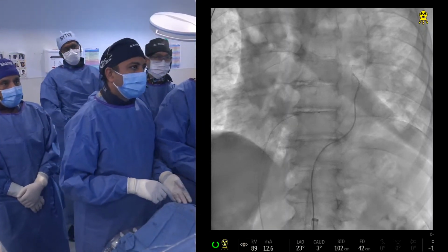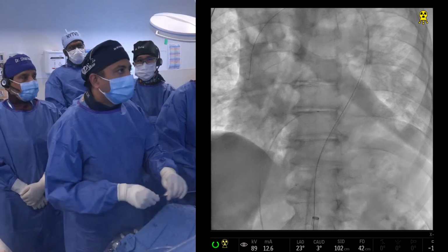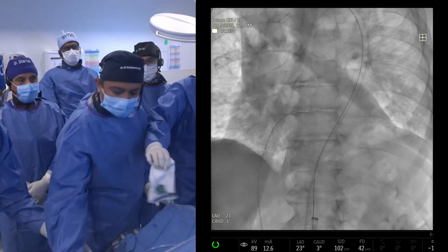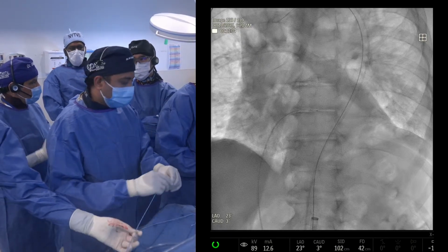Although that trial was flawed in my opinion, having an 11% mortality, which has never happened with the, but in that trial did happen, that was a big difference. But yes, appropriate cases and this sizing. I think what we are learning more and more is do maybe overinflate but undersize, right? I mean, that's what is happening.